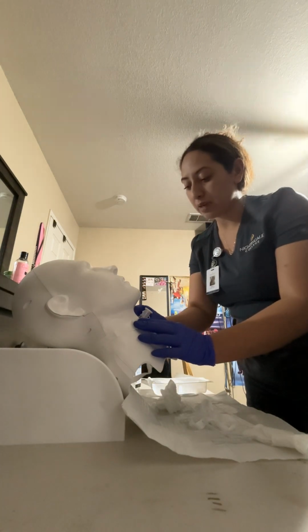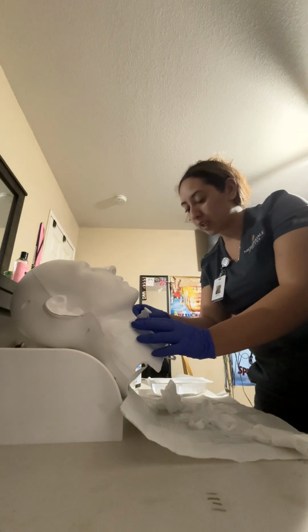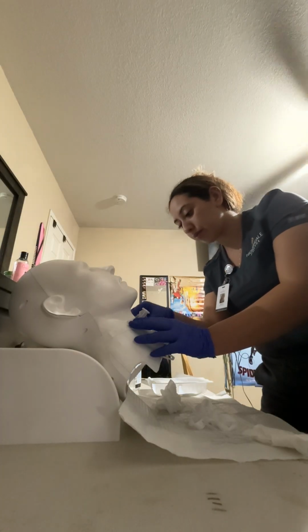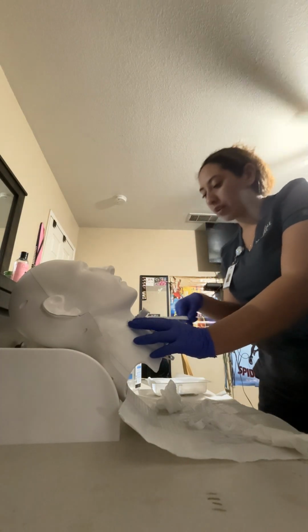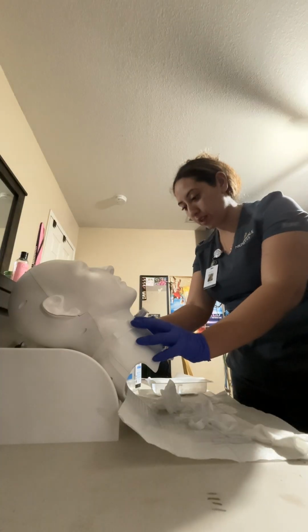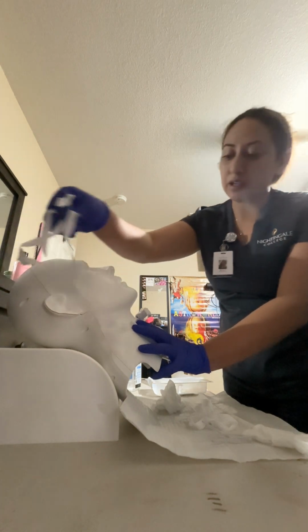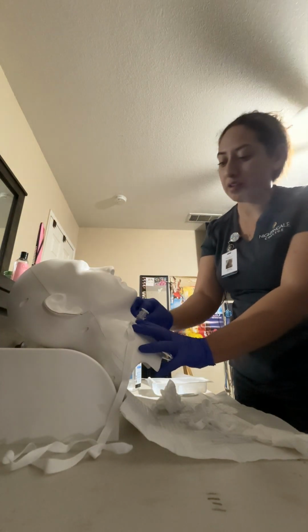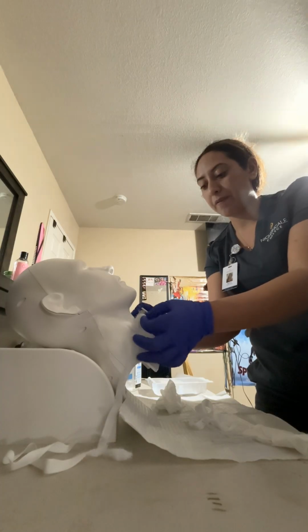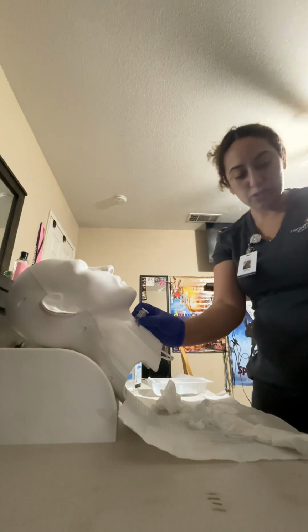Okay, so at this time, I am going to lightly remove his trach ties by untying it. Okay. For this part, I will ask my patient if it's okay if he can lift his head for me. So patient will lift his head slightly so that way I can pull it out on the side. Okay. So we will apply pressure here and just assure that this does not become dislodged. Okay. Now we will put the old trach ties into the trash.